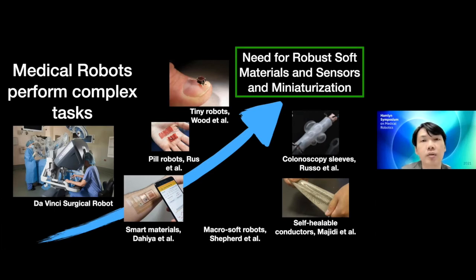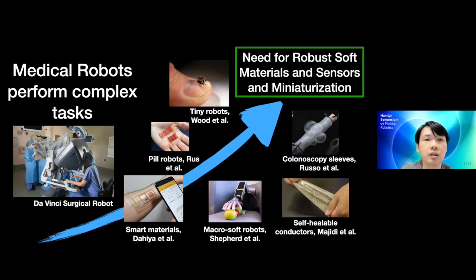They require a human, right, in the loop to actually operate the machines that actually perform surgery in keyhole surgeries in humans. And I think there's some exciting work in material science and also soft robotics fields where we are looking at developing strategies to allow some of these procedures maybe to be performed by robots. Could be autonomous, could be remote controlled, right? I think soft robotics, soft materials can play an increasingly exciting and important role once you want to interface with the human body.